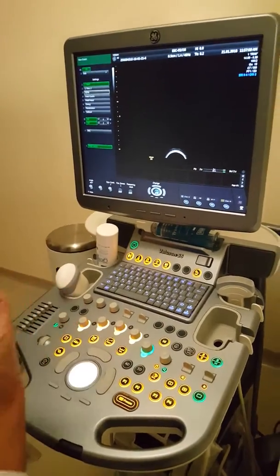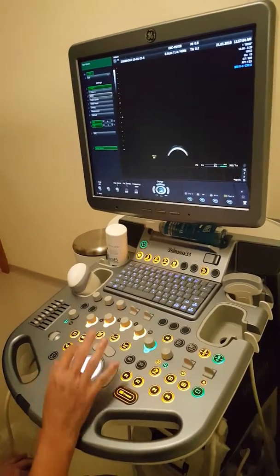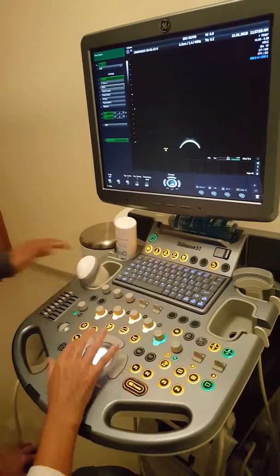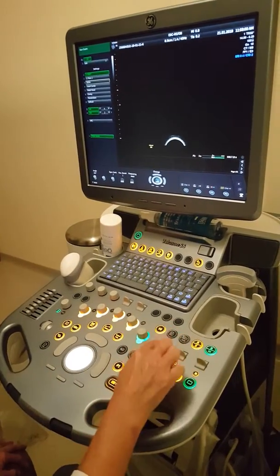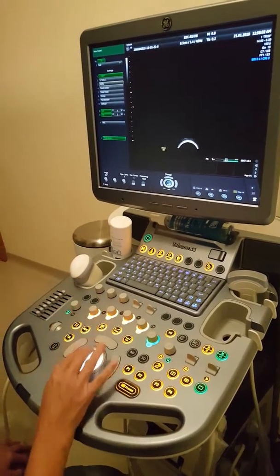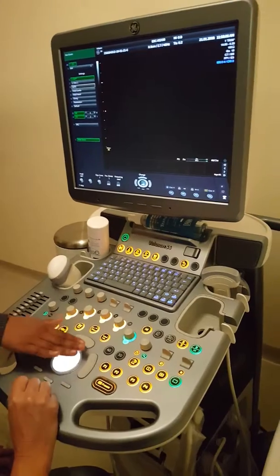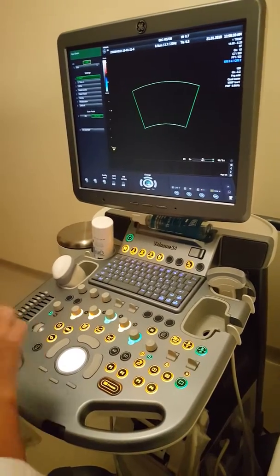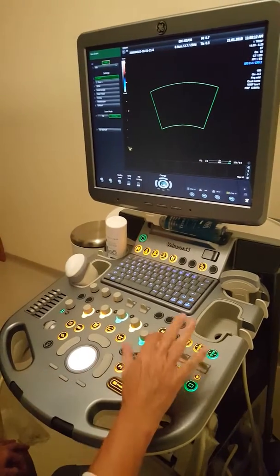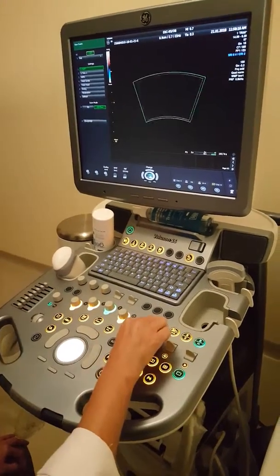If I would enlarge my picture, because normally you want a bit bigger, so I'm still in my first trimester thing. You zoom it. If you want to enlarge your picture, yes. So you're going to zoom this, okay? And then you're going to put the color here. And the same here. So this is an important one, zoom, enlarging the picture. And that is just turning around.